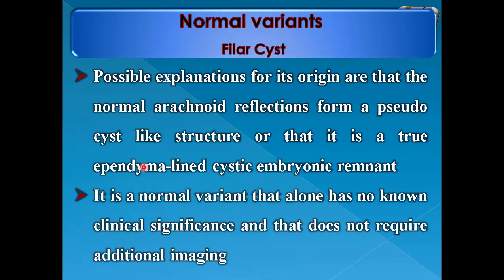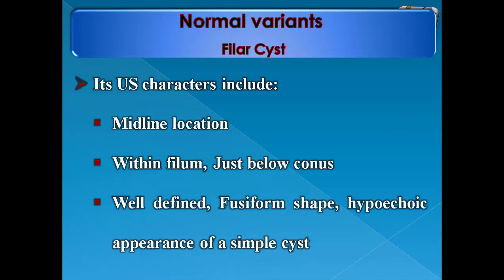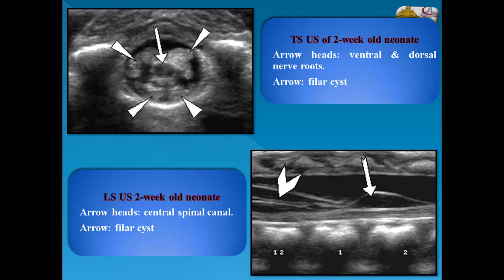Filar cyst: possible explanations for its origin are that normal arachnoid reflections form a pseudocyst-like structure, or that it is a true ependymal-lined cystic embryonic remnant. It is a normal variant that alone has no clinical significance and does not require additional imaging. Its ultrasound characteristics include midline location within the filum just below the conus, well-defined fusiform shape, and hypoechoic appearance of a simple cyst.